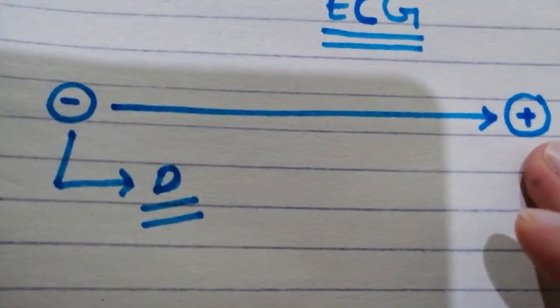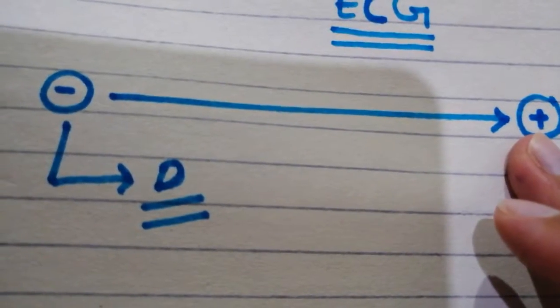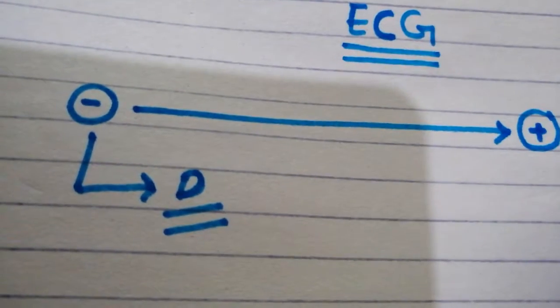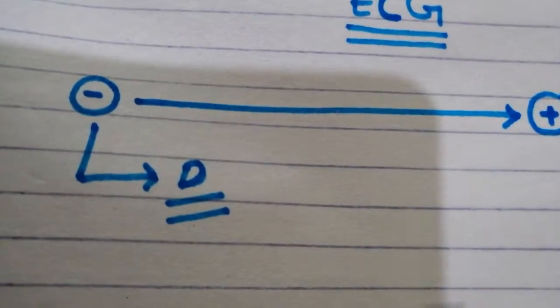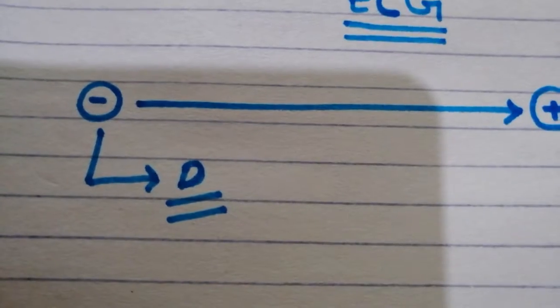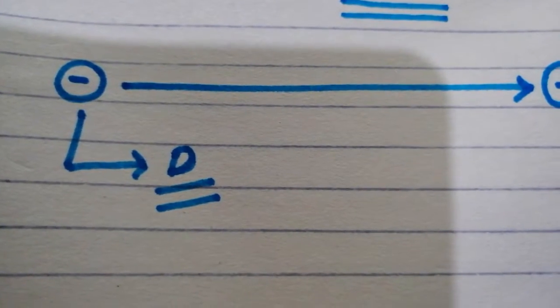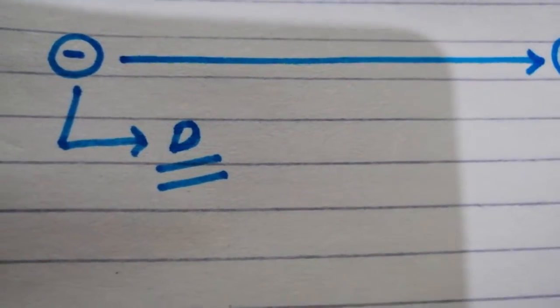And where the cardiac muscle fibers are still in the polarized state, the inside, because of RMP, will be negative, the outside will then be positive. And so there will be electrical currents generated in the body fluids, and because the body fluids are excellent conductors, some of this electrical current will be transmitted to the surface of the body, and you can register it with electrodes. And we have different electrodes and different leads, and that will make sense.